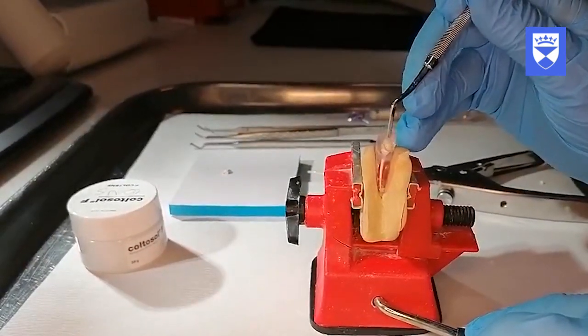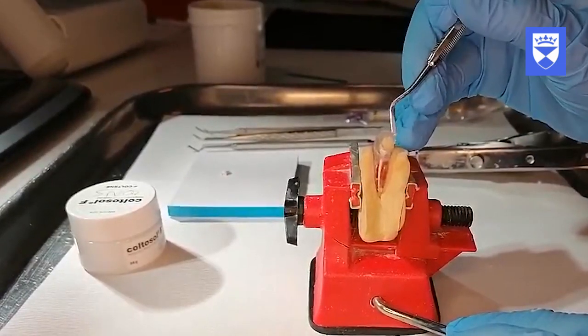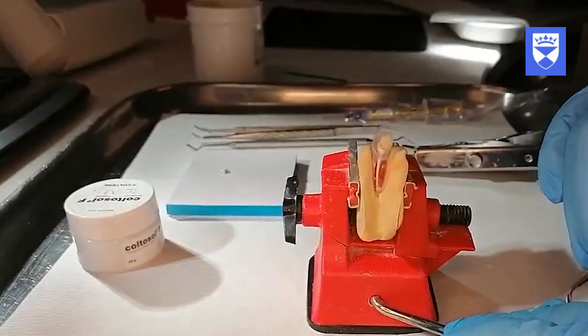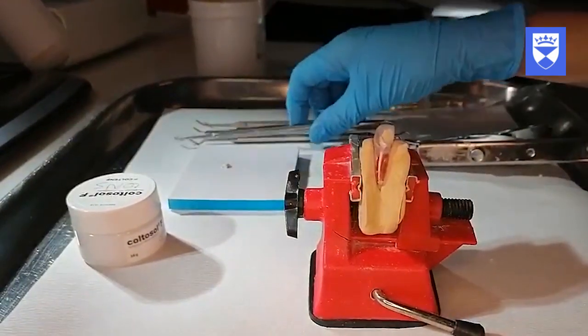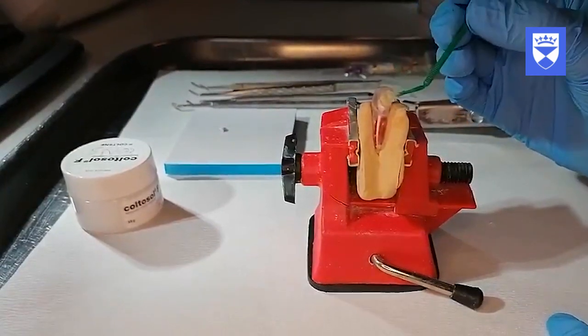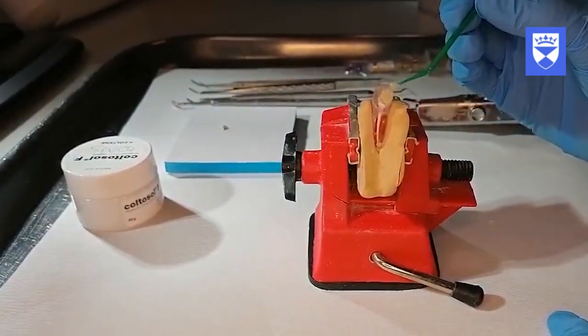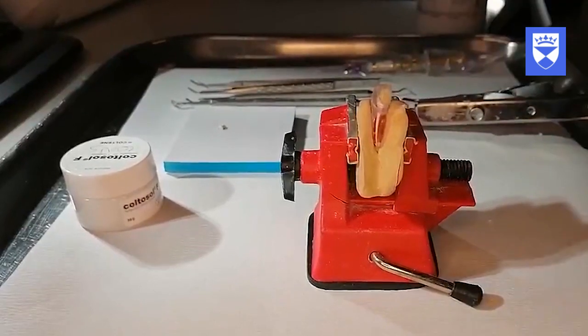Seal the cavity with a Fuji GI restoration to make identification easier at the next appointment. Ensure the margins of the glass ionomer restoration are well adapted to prevent coronal leakage. Cover the glass ionomer with vaseline to maintain moisture control while the restoration reaches its full set. Once the temporary restoration is in place, the rubber dam should be removed, the occlusion checked and post-operative instructions given to the patient.